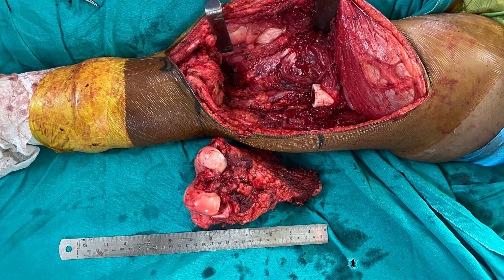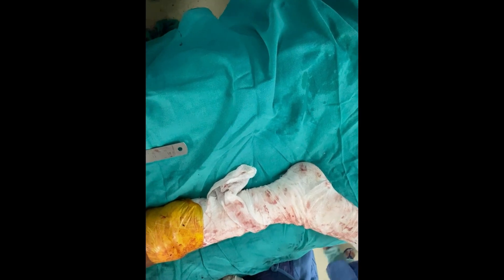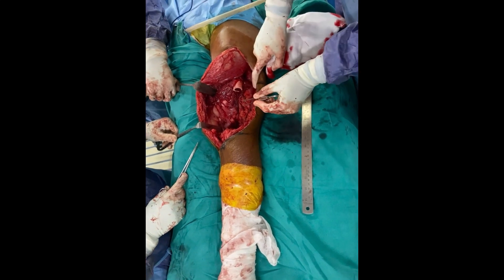Step 1: Incision and Tumor Removal. The surgical team makes a precise incision to access the affected area of the distal femur where the tumor is located. Carefully, the tumor is removed with wide margins.